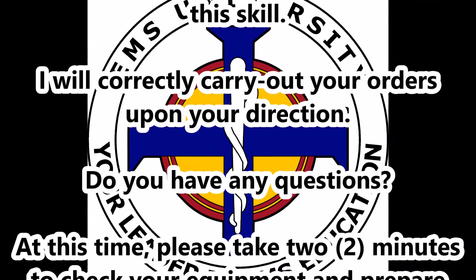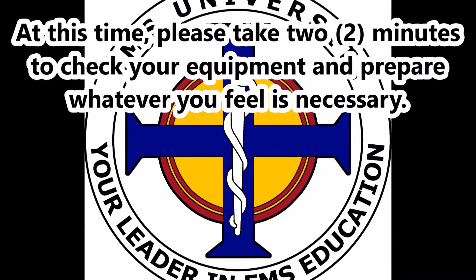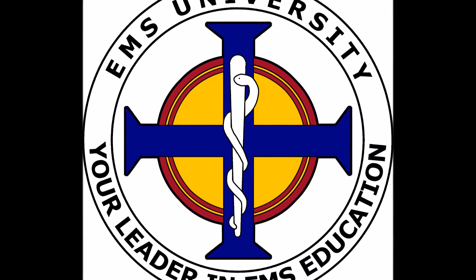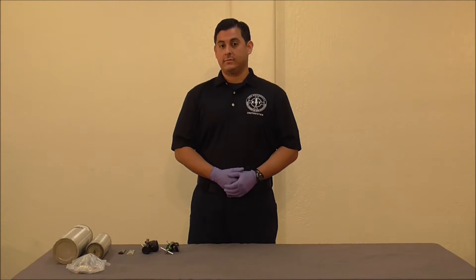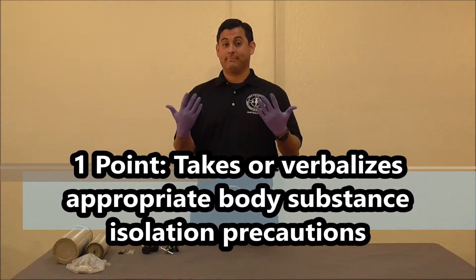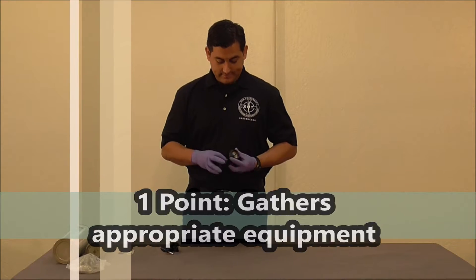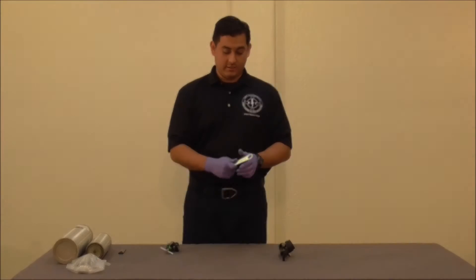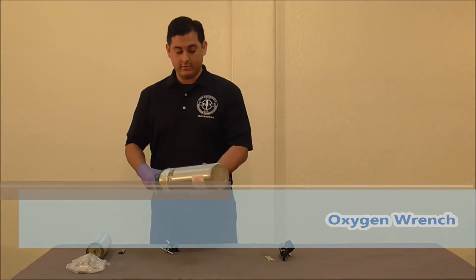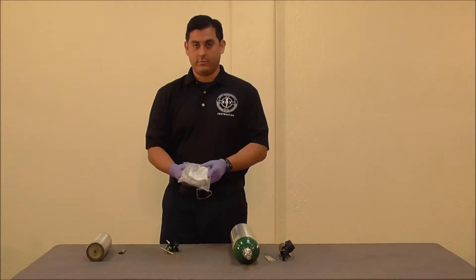I will serve as your trained assistant and will be interacting with you throughout this skill. I will correctly carry out your orders upon your direction. Do you have any questions at this time? Please take two minutes to check your equipment and prepare whatever you feel is necessary. The first step is to verbalize appropriate body substance isolation precautions. Be sure to gather the appropriate equipment, which will include an oxygen regulator and o-ring, oxygen wrench, oxygen tank, and a non-rebreather mask.